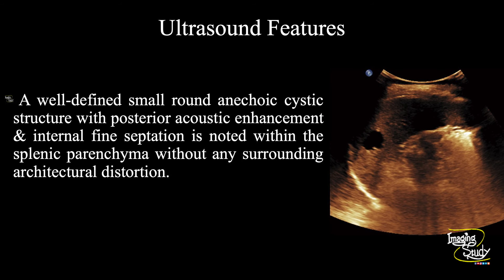In summary, a well-defined small round anechoic cystic structure with posterior acoustic enhancement and internal fine septation is noted within the splenic parenchyma without any surrounding architectural distortion. This feature suggests it to be a case of splenic cyst.